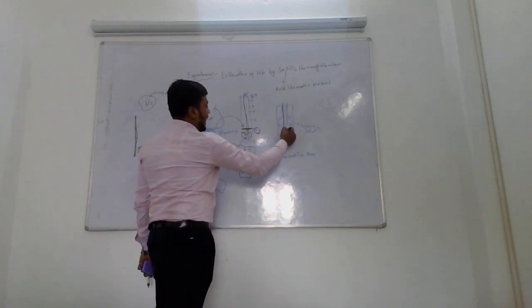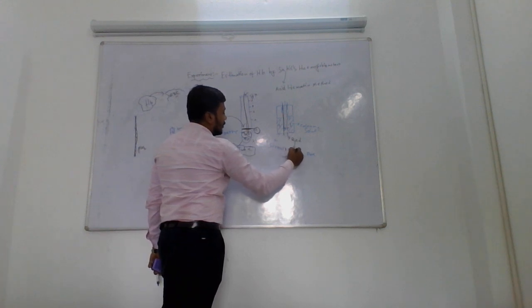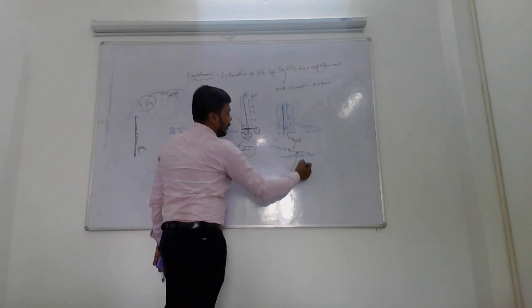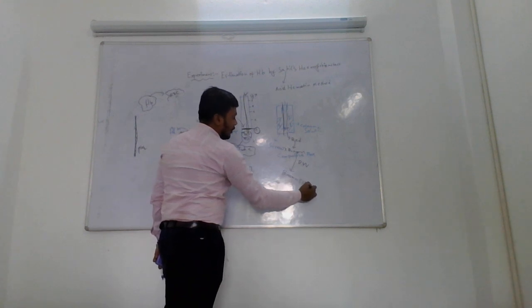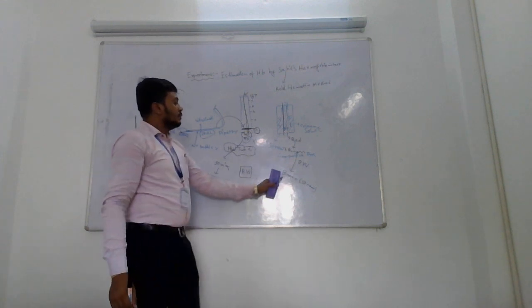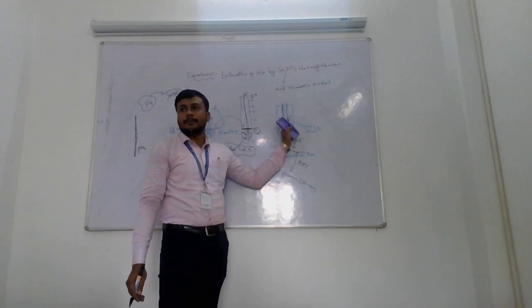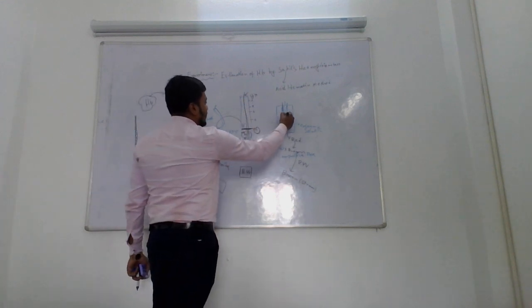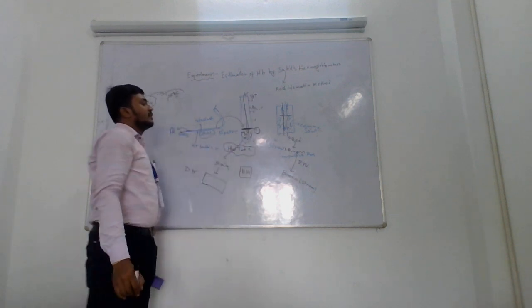Initially, before adding any sample, it is red, then dark brown after the conversion. But after adding distilled water, its color changes to brown or straw. So I have to add distilled water until these three colors are the same. When the three colors are the same, this is the final result of the experiment.